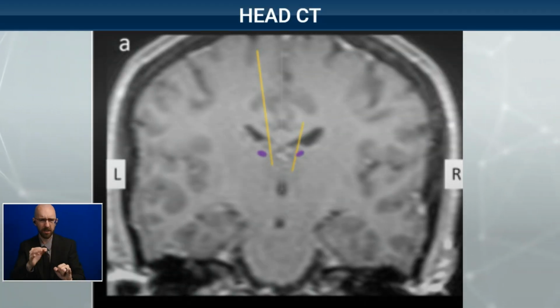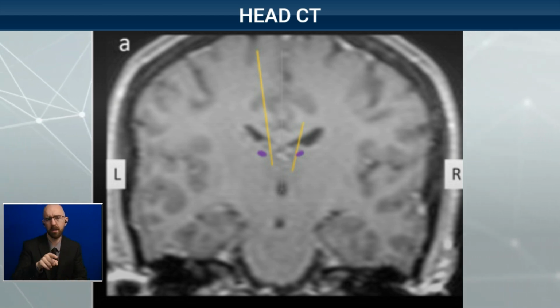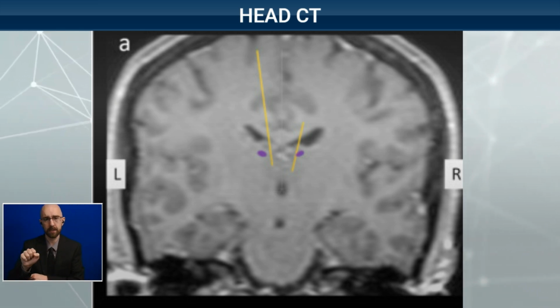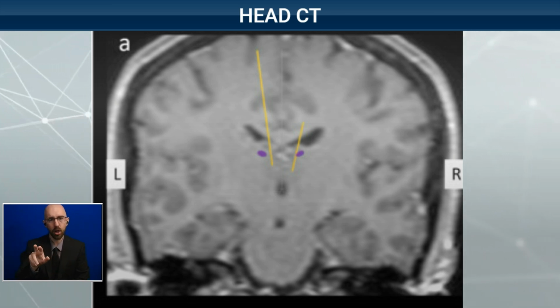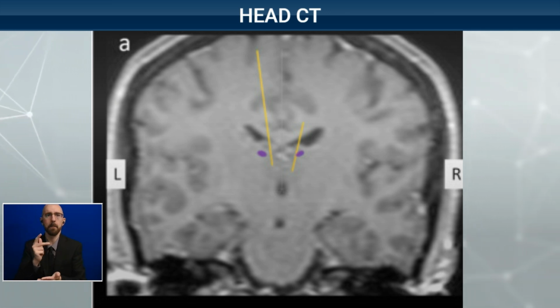So this is an example of deep brain stimulation for epilepsy, targeting the anterior nucleus of the thalamus, and the yellow lines represent the wires that are implanted. Anterior nucleus of the thalamus stimulation is an FDA-approved treatment for focal epilepsy. Actually, Amy's is a little bit different because she has generalized epilepsy, and we treat that with a different target also within the thalamus called the centromedian nucleus for generalized epilepsy.